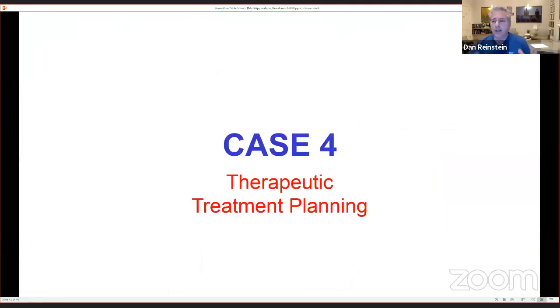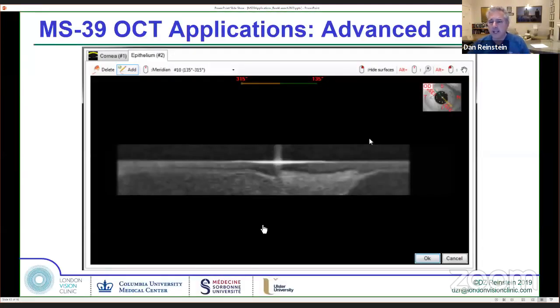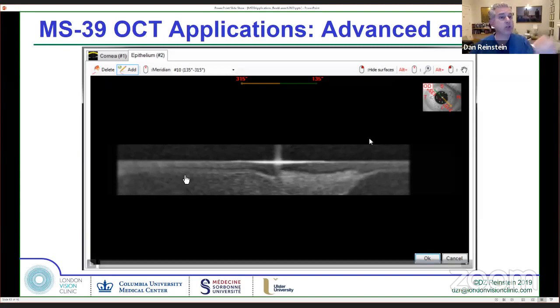So very, very nice. And finally, Rohit mentioned this, and I want to emphasize that Dr. Siiler mentioned this also. He talked about the repeatability. And he did mention checking the epithelial segmentation. I think that if you're going to make a surgical decision based on epithelium with this device, you need to manually check the segmentation every time. Because you can't rely on an algorithm that is looking at gray on gray to be as good as you.